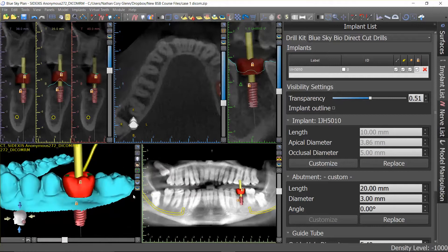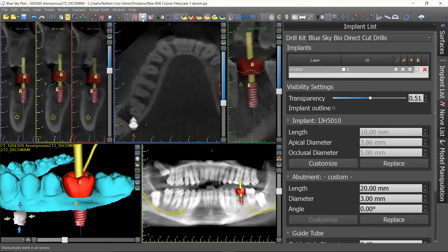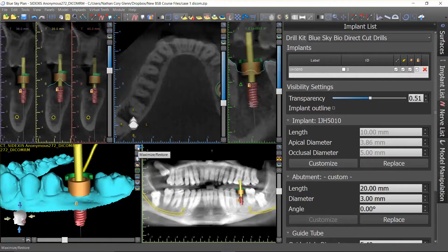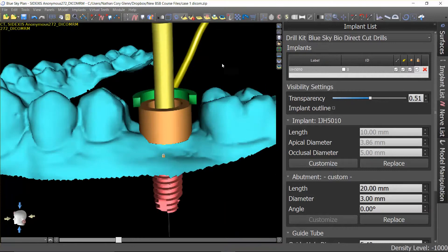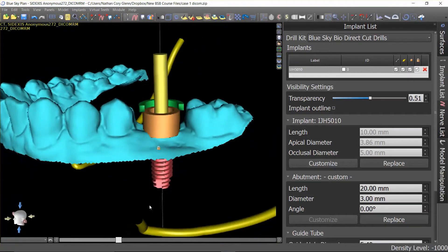I've got the guide tube turned on, but this tooth is in the way and I don't need it anymore since I've already done my treatment planning. Up in the top menu you'll see there's the plus implant, nerve, and tooth buttons, but there are also just implant, nerve, and tooth toggles that purely turn on or off the visibility. If I click the tooth toggle you'll see the tooth disappear — it doesn't get rid of it, I can bring it right back, it just removes it from visibility. Now maximize the 3D window and you can see the guide tube in position.